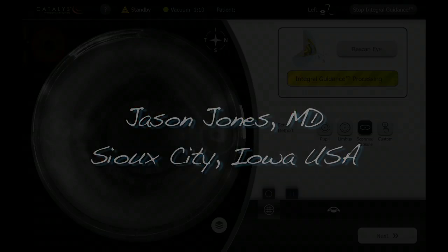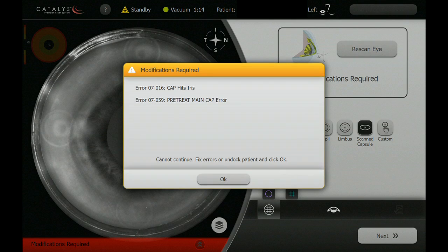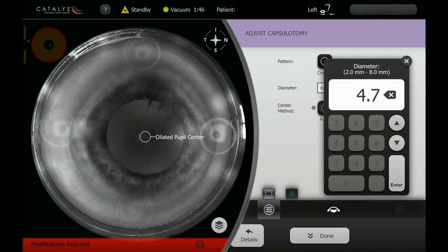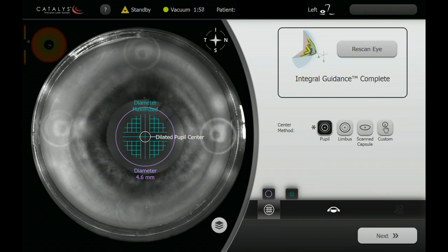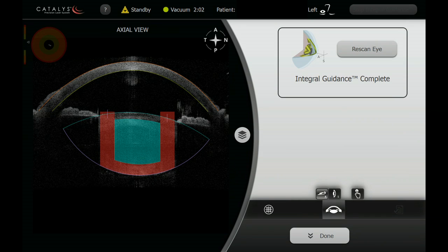This patient with pseudoexfoliation desired correction of a relatively high amount of astigmatism. At the beginning of the Catalyst procedure, we can see a relatively small pupil as detected by the computer. We are going to adjust the pupil diameter a little bit smaller, which is consistent with pseudoexfoliation. On the slightly smaller capsulotomy diameter at 4.6, it passes the margins safely.